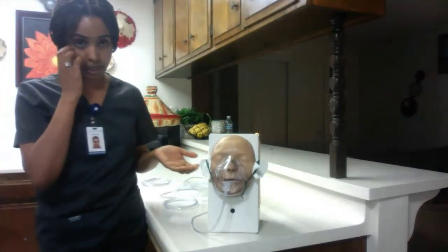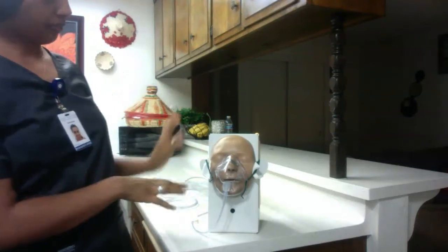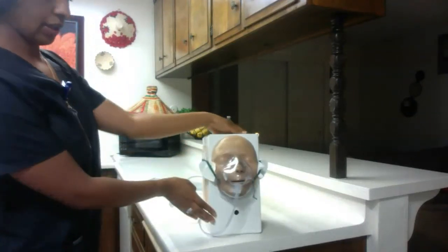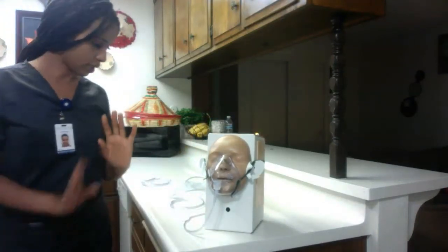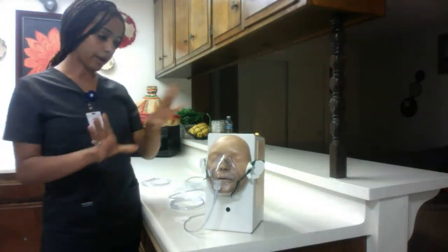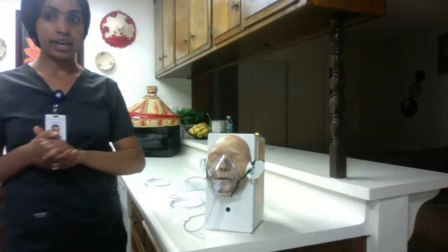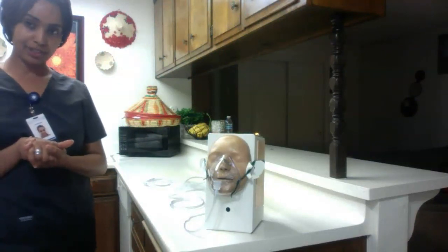This is how we put on the mask. We make sure to assess the skin. After the patient finishes the oxygen therapy, all equipment is to be discarded. I've completed my procedure — I'm going to go ahead and wash my hands, undo the privacy, and document my procedure. Thank you.